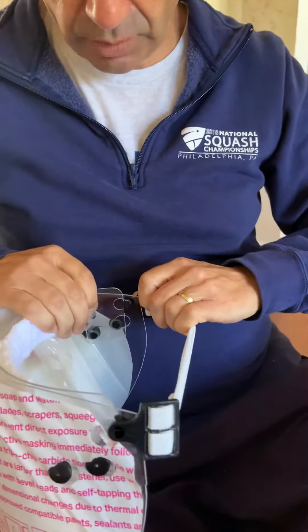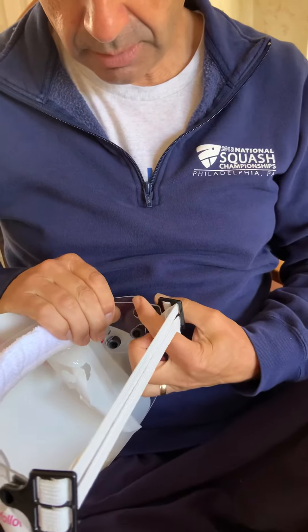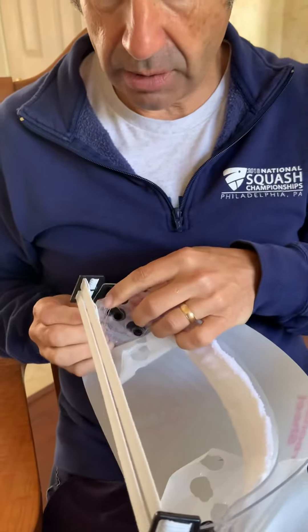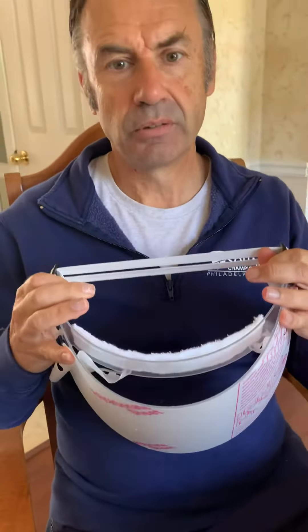Once you've done that, you can push it back, and now the button is locking the headband, both ends, and your iMask Plus face shield is sturdy and ready to go. Hope that helps.